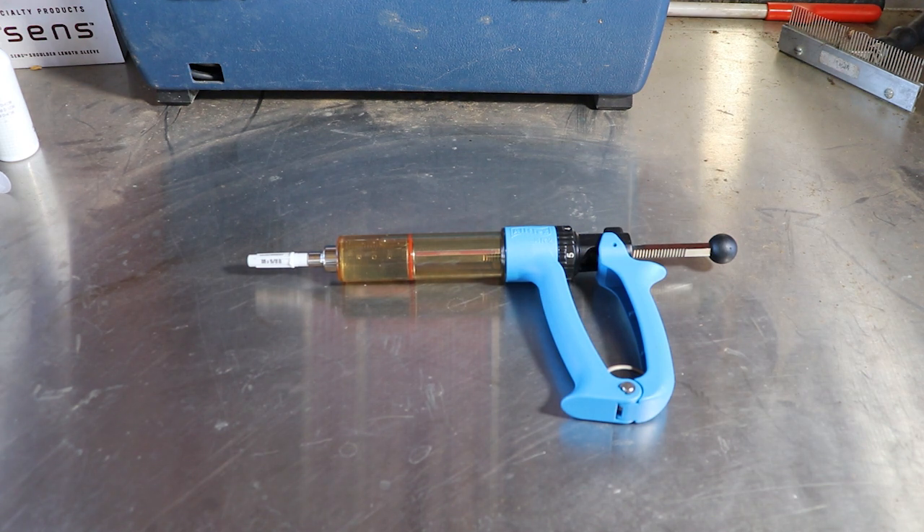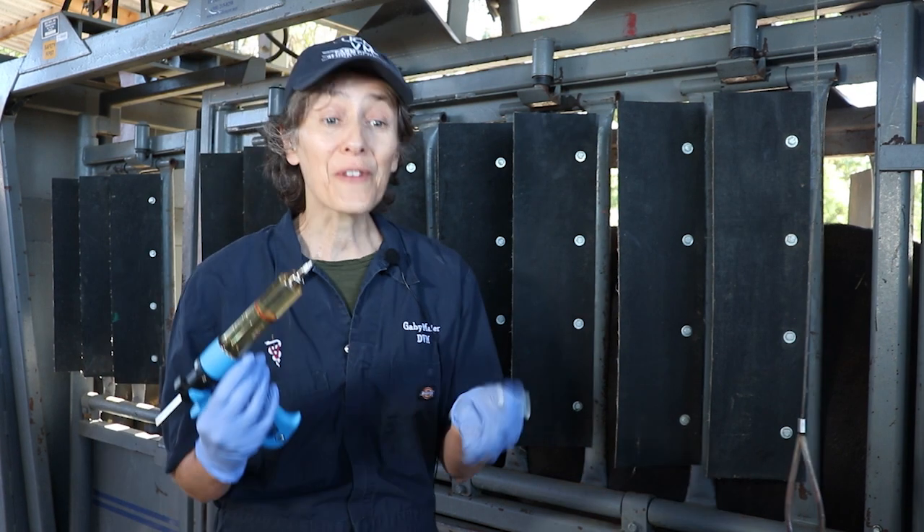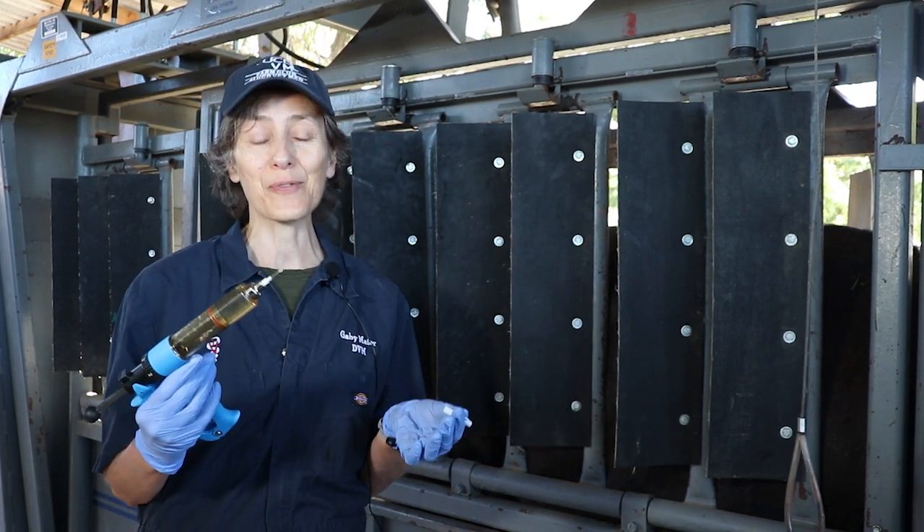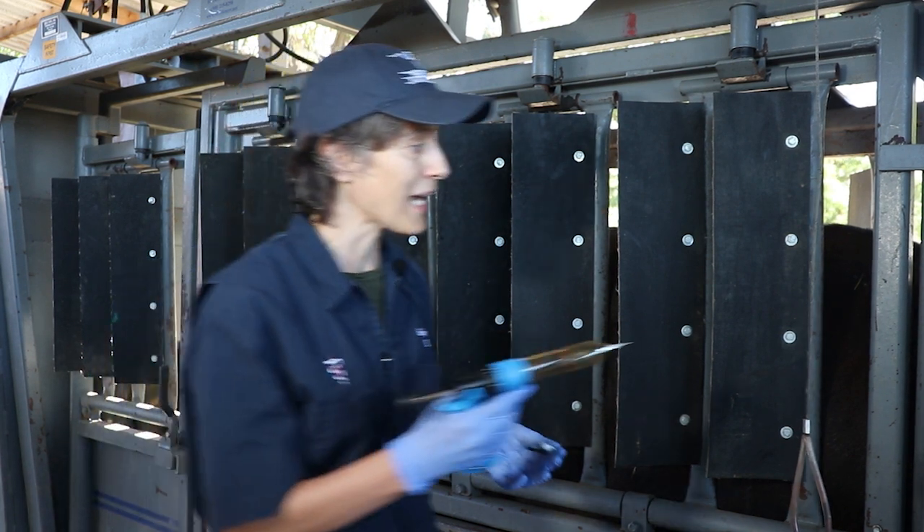Many of the injections we give to cattle are done with an automatic syringe such as this one. They're fairly easy to use and they're great for things like vaccines where small amounts of the product have to be given to each animal.